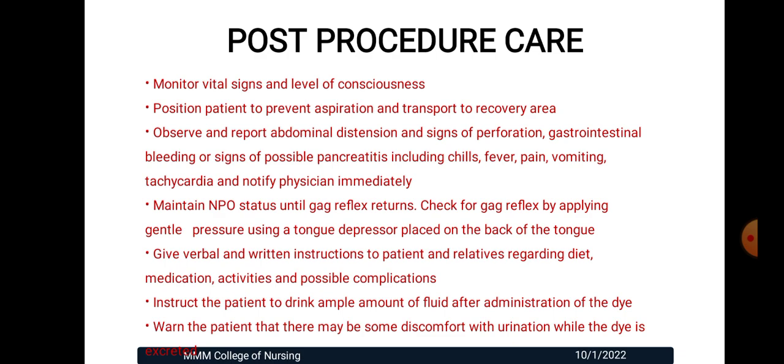And maintain NPO status until the gag reflex returns. Check for the gag reflex by applying gentle pressure using a tongue depressor placed on the back of the tongue.